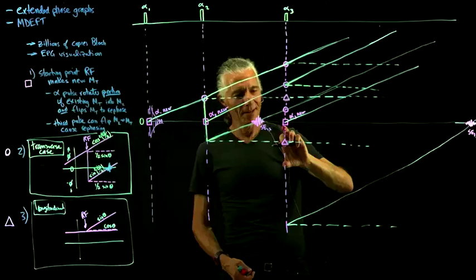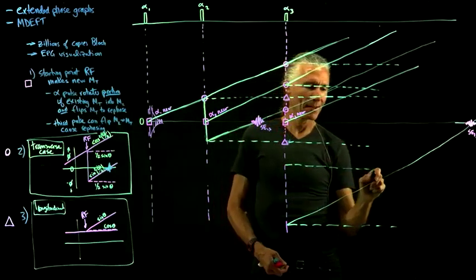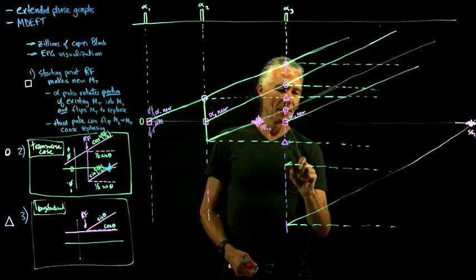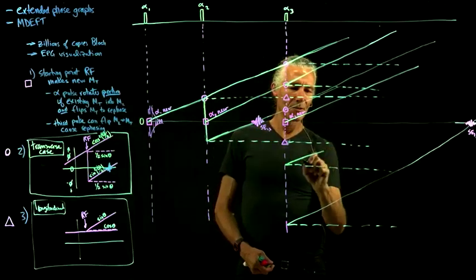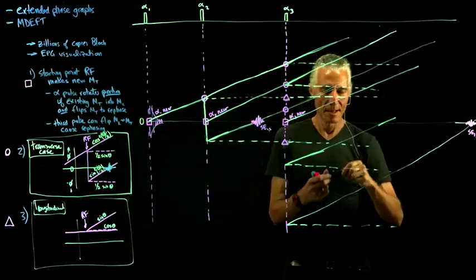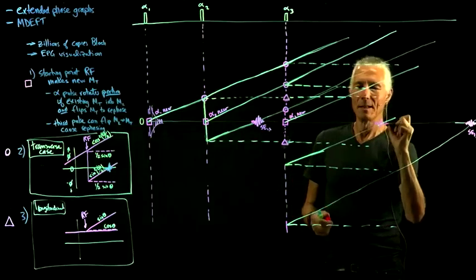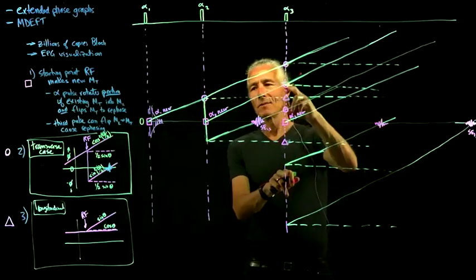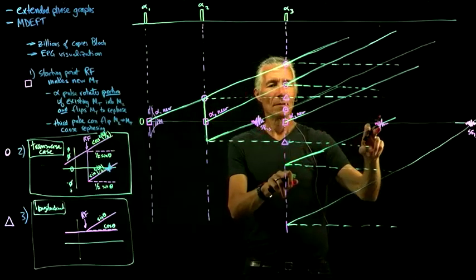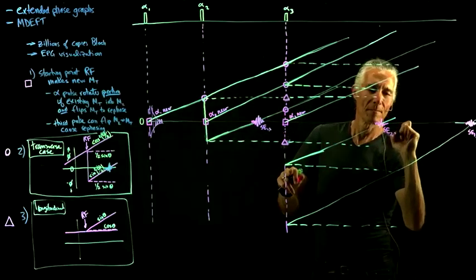This distance down, and save some inverted phase longitudinal, and then also do some rephasing, and that guy will make another echo. So this guy is the combination of pulse 2 and then pulse 3. So this is spin echo 2, 3.